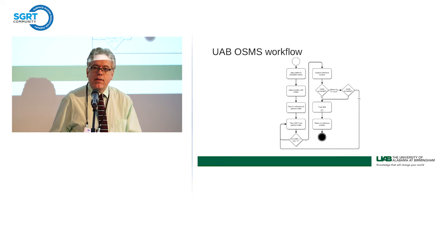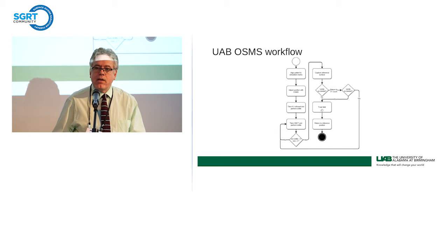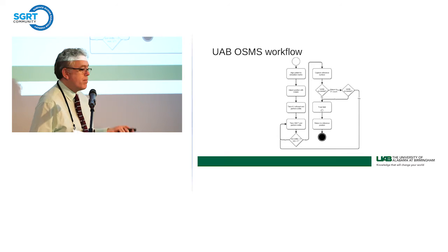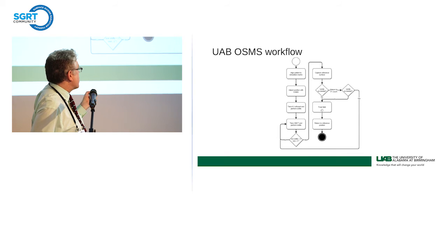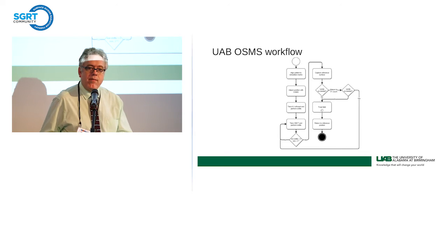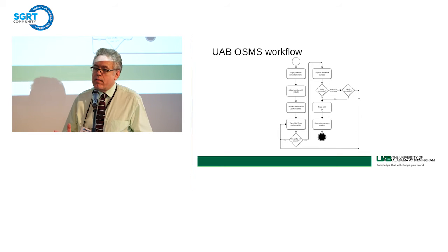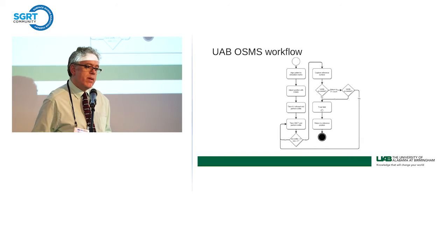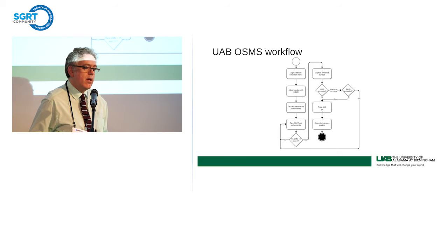So it's basically a dynamic live DRR in the image registration to create a 6 degree of freedom setup. After that, we do a cone beam CT with a 6 degree of freedom couch to perform the shifts. We have an internal tolerance of 0.5 millimeter and 0.5 degree as the rule of thumb for whether or not we're going to repeat a cone beam CT after we apply the shifts.